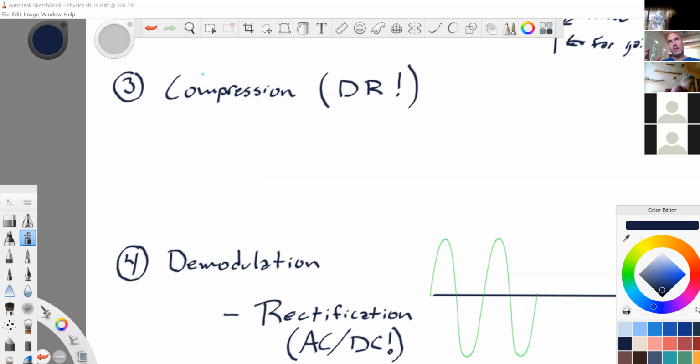It doesn't go from bright to less bright to kind of dark to more dark to hypoechoic to anechoic. It kind of goes from bright to anechoic really quick. So there's more contrast, and therefore more contrast resolution. But that's kind of one resolution that I'm not so sure I want. I'll get back to you guys on that. I've done research on this a number of times, and people actually have very different ideas on that.